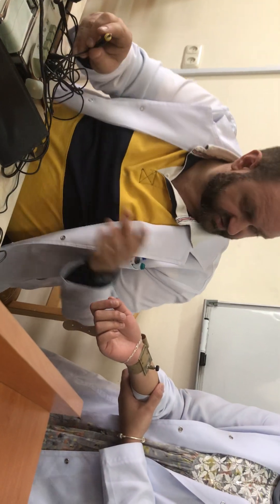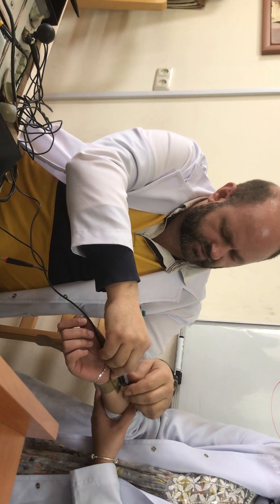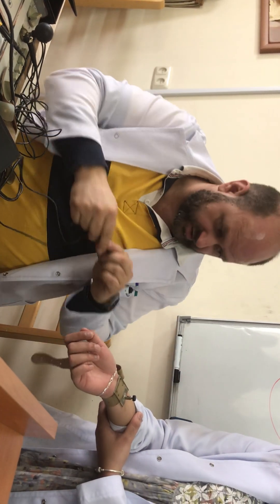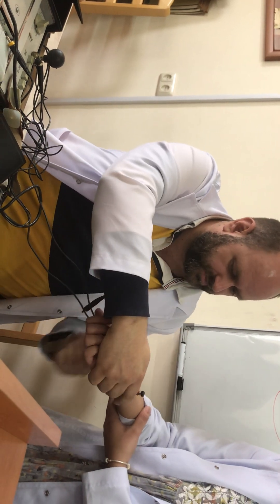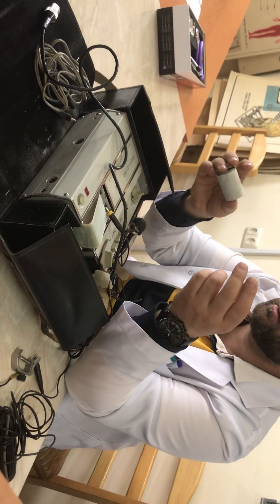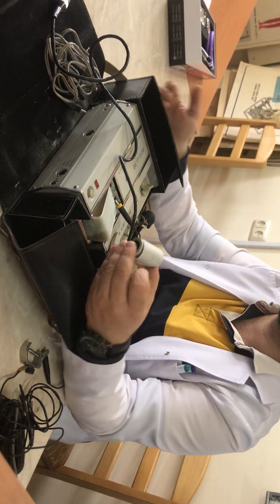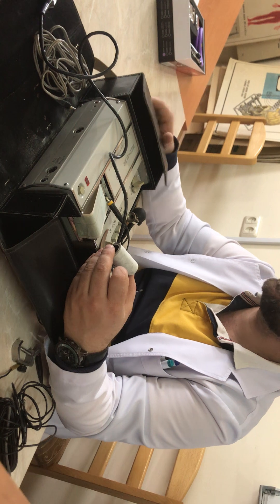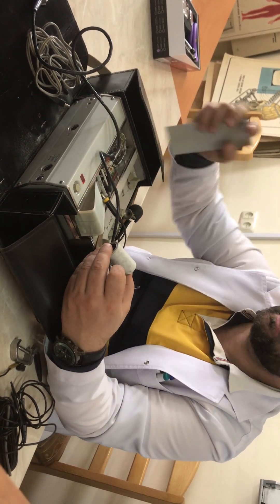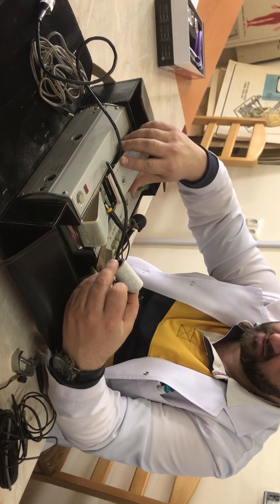Making the electrodes — first is the right hand, the red one, which we fix here. The registration happens on specific paper. As you can see, we don't use a regular pen or pencil during ECG because it is a continuous process. Daily we perform a lot of ECG registrations, so it is impossible to use a fast-changing regular pen. Instead, we use a specific metallic pen which draws under the paper.